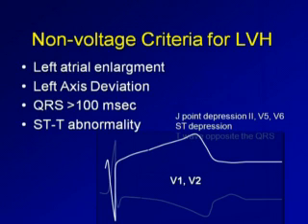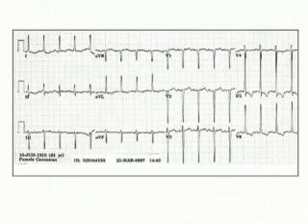That's going to be most prominent in 1, aVL, V5, and V6. Looking from the other side of the heart, the mirror image of that is going to be in V1 and V2, where you may see a tall asymmetric T wave that may start to drag the ST segment upward slightly. When you see this repolarization abnormality of LVH, you can swing a gavel. You know the patient has LVH. You're very specific in your diagnosis. But it's not a very sensitive finding for LVH. And it tends to indicate a pressure-loaded chamber, like poorly treated hypertension or aortic valve stenosis.